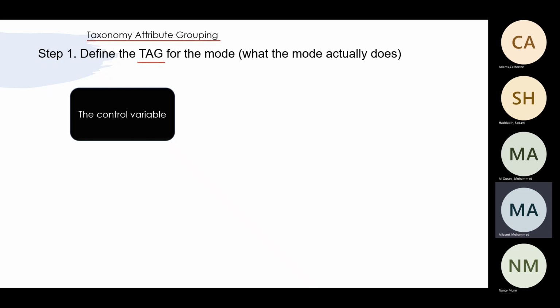That's why knowing this matters, because nowadays we have a lot of companies with a lot of different names, but as a physician, you need to know what the machine is doing. Because you can be one of two types of physician. You can be the physician standing beside the bedside saying, oh, he's over-breathing the vent, paralyze him. Or you can be the type of physician standing there asking, what type of mechanical ventilation is this? Let me see what's going on. What's wrong with this mechanical ventilation? Let's fix this and fix this.